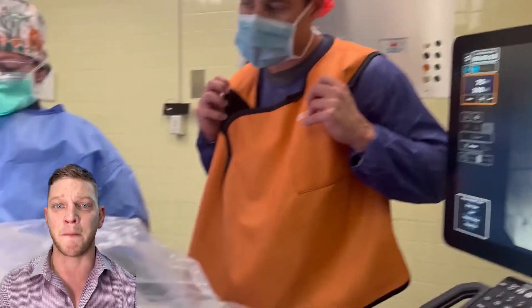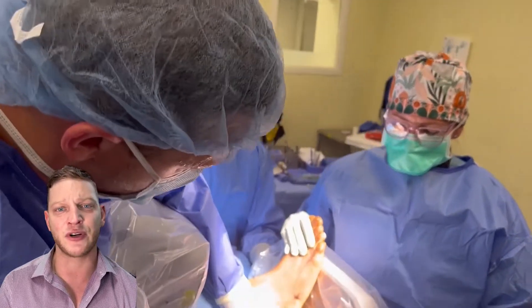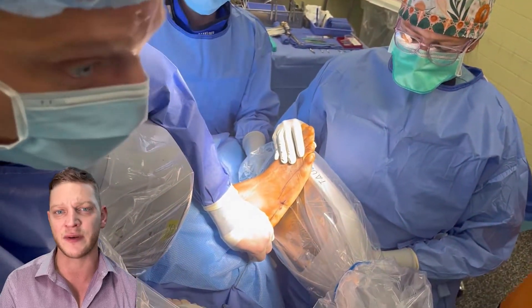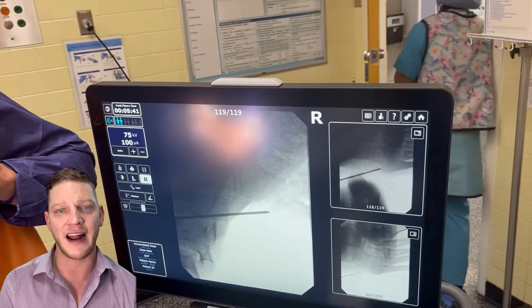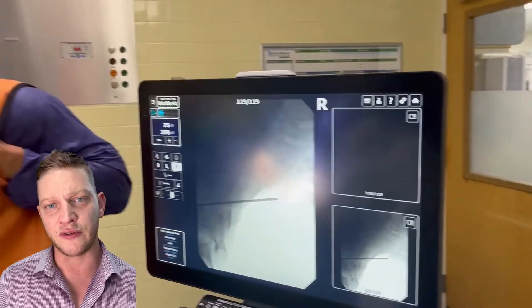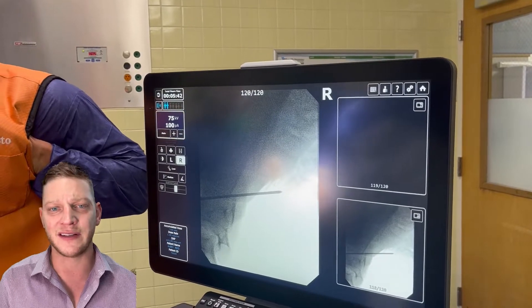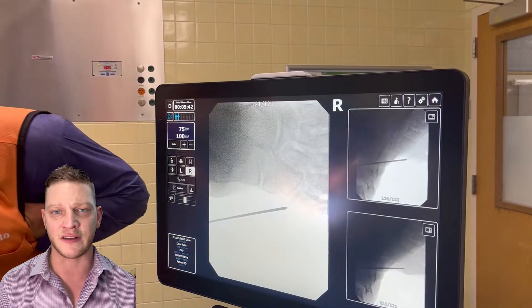They were also using big c-arms. I'm using a mini c-arm — I actually had to push my case back to get access to the mini c-arm. This is a rather young patient, and I didn't want a big c-arm exposing him to so much radiation. The mini c-arm produces a little bit less radiation; it may be insignificant, but it's something I want to consider for him.